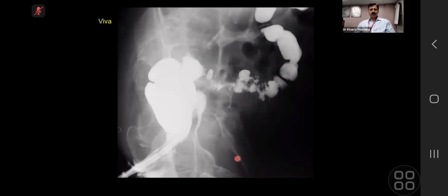Okay, I'll take over. Now, this is an extremely good exam case, and the same case can come to you on other modalities like CT, etc. also. Similar case, even MR. Now, what is happening is that this is the rectum, this is the sigmoid colon. Diverticulum here, diverticulum here, diverticulum here, diverticulum here, diverticulum here. So there are multiple diverticuli. With that, from here to here, there is a stricture. But if you look carefully, these are not deep ulcers. This is that serrated mucosa which we had covered. So this is a diverticular stricture.